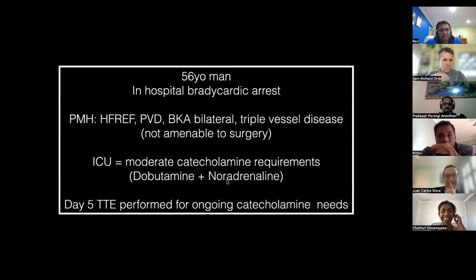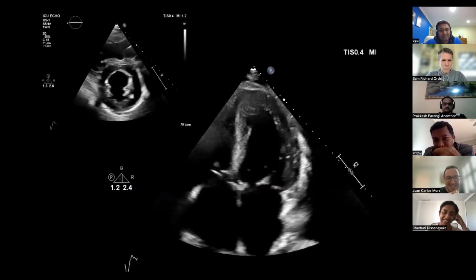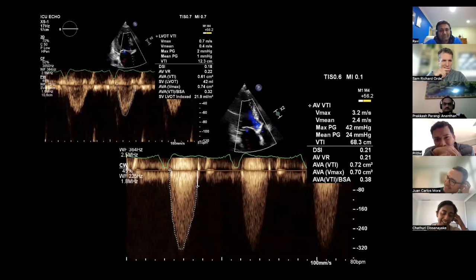So this is severe aortic stenosis with low flow. It's hard to know what the LV function was like before, but it seems like there might be some recruitability given those gradients are impaired, but the numbers are still leading me towards a severe diagnosis. Yeah, nice.